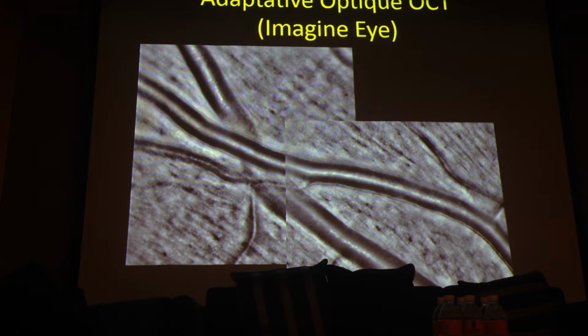And so you can see that we have many new works to do. It's just the beginning. OCT angiography has been on the market for only about one year with a few machines. Now we have many more machines, but it's just the beginning.